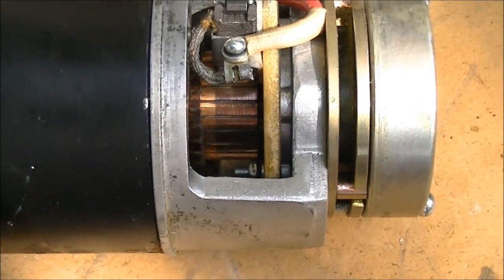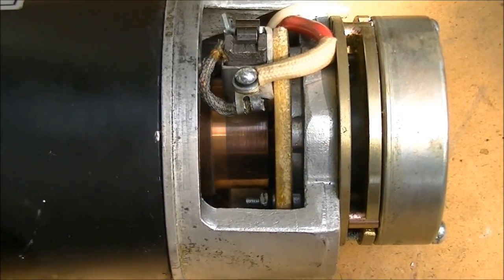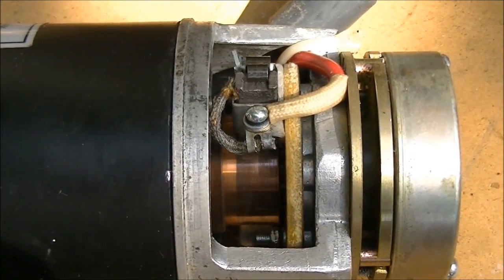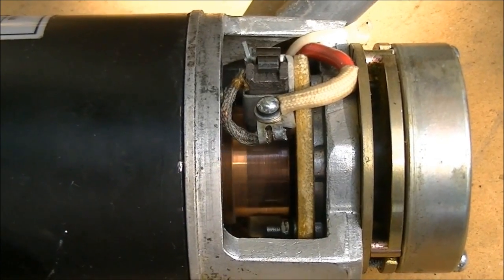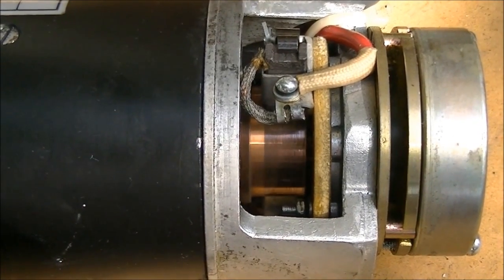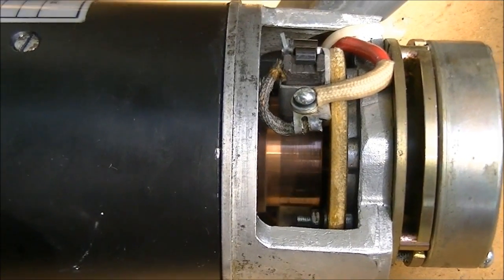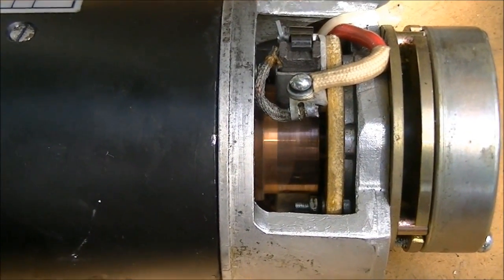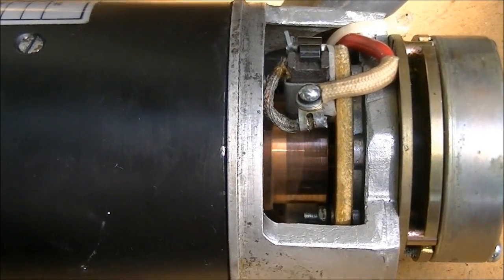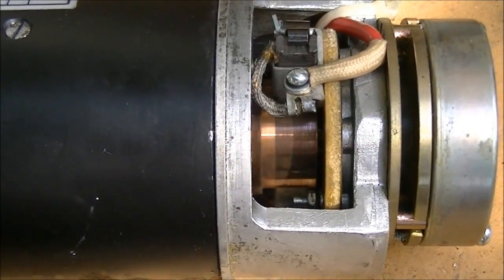I'm going to try to run it now and see what it sounds like — I have it all hooked up and I'm turning it on. If you watched my last video you could hear that this motor sounded terrible, and it's a whole lot more quiet now. I don't know if it's really any stronger, but it's a lot better. At least it sounds a whole lot better.